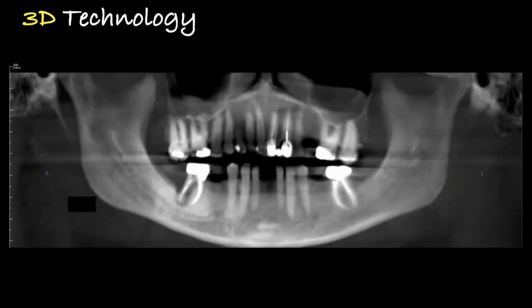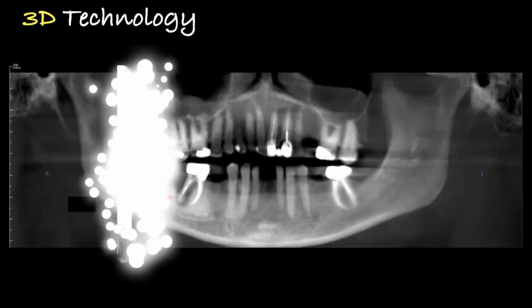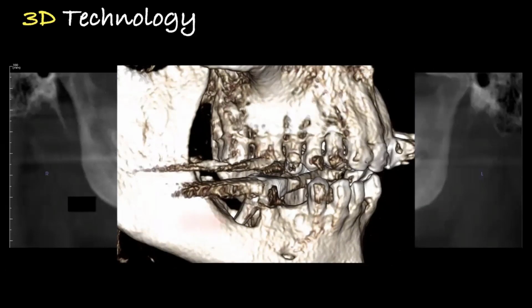Cases like this, as a periodontist, I say, well, is that tooth root cracked, or how bad is the defect in that area? Well, look at that on a three-dimensional rendering. You say, gosh, there's no bone left buccal or lingual around that distal root, and the furcation is completely exposed. This tooth needs to be removed. We probably have to graft. If we're going to do an implant, it's going to be through the mesial root, and we're just going to have to graft like crazy.